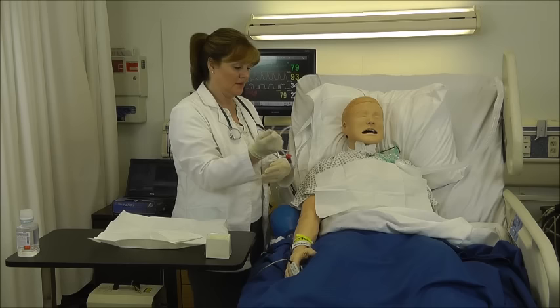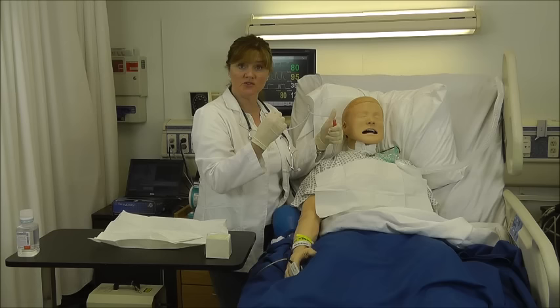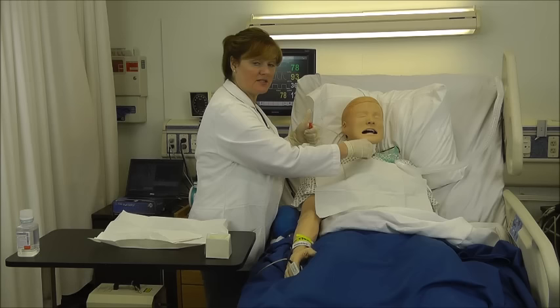Never cover the suction catheter hole on the way down because you can tear the trachea lining. Keep your thumb off that device on the way down. As I begin to suction, I advance the catheter, and I don't let my right sterile hand touch his gown, the drape, or his inner cannula. I advance until I meet resistance. That's the carina. I'll pull back 1 inch.